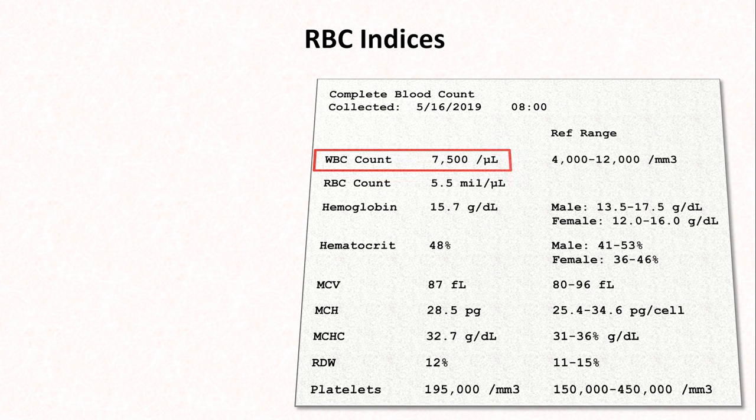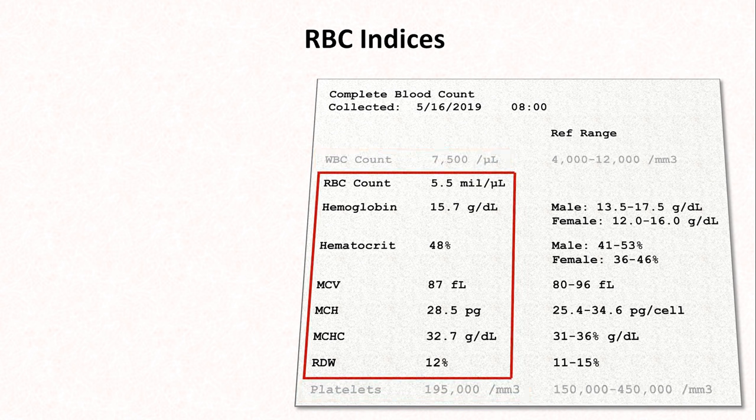We see the white blood cell count at the top, and the platelet count at the bottom, neither of which are part of the focus of this particular video. That leaves all of these, which are all about the red blood cells. Let's go through them one at a time.